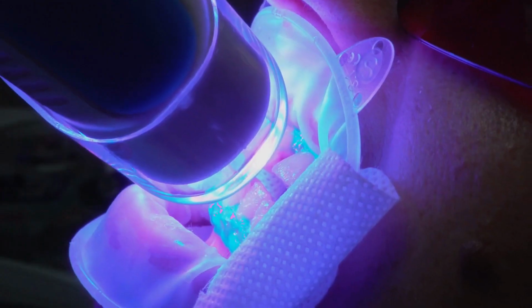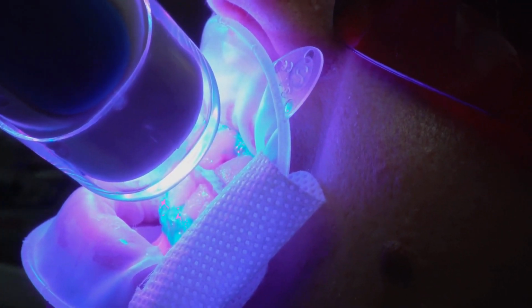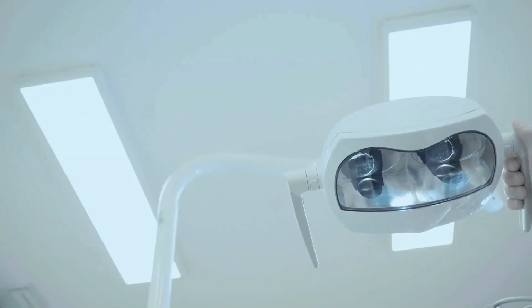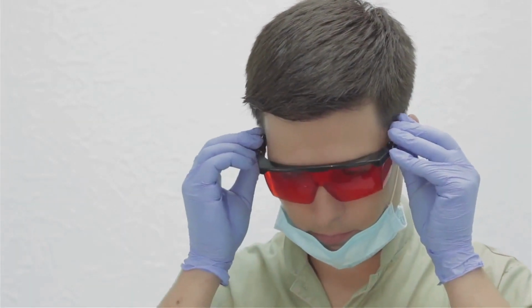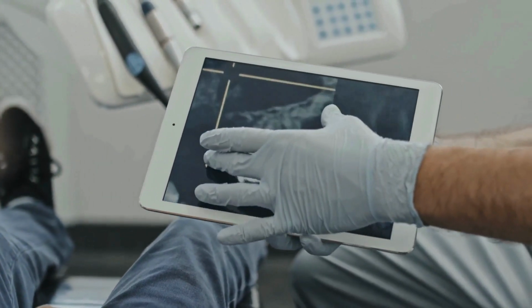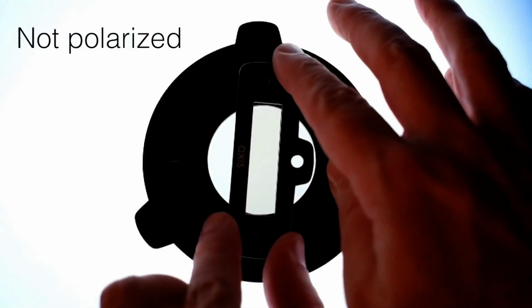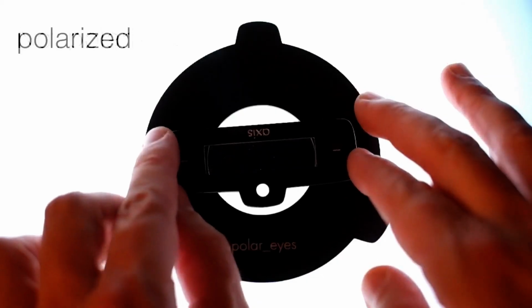The magic of cross-polarized photography lies in the fascinating science of light polarization. Light, in its natural state, is a wave that vibrates in all directions. Polarizing filters act like selective gates, allowing only light waves vibrating in a specific direction to pass through while blocking others. When two polarizing filters are used in conjunction, with their polarization directions perpendicular to each other, they create a system where only light waves that have been twisted by the subject can pass through.